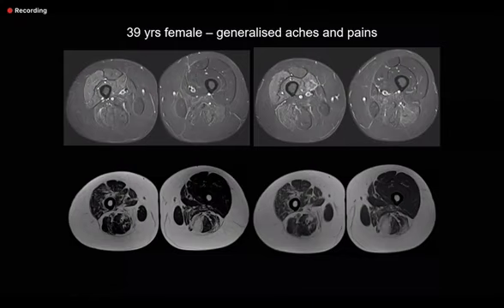I would like to ask about any previous. So denervation bilateral. Sorry, I take that back. I think this could be because of a DOMS type of injury where the patient may have had strenuous activity when they're not used to it, and subsequently got these appearances in the MR scan. Then why will there be atrophy?